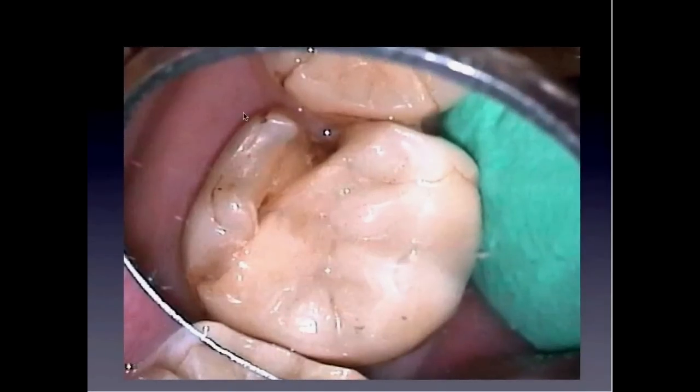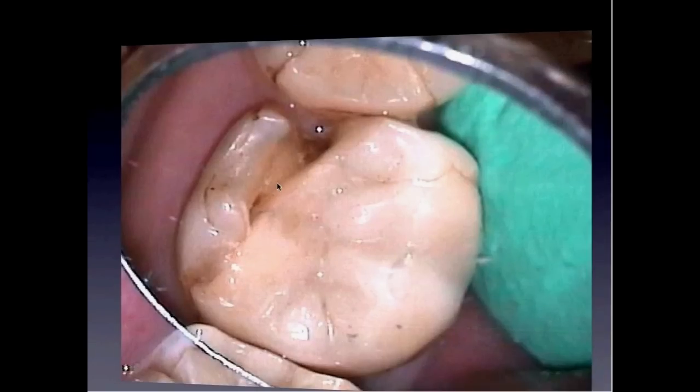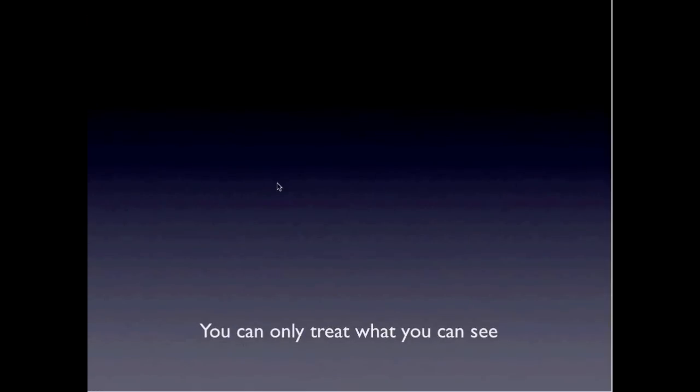Or this fractured tooth. You can show the patient that the fracture is very deep, and that when the fragment is removed, you can't do anything more about his tooth. So it has to be extracted. You can really only treat what you can see.